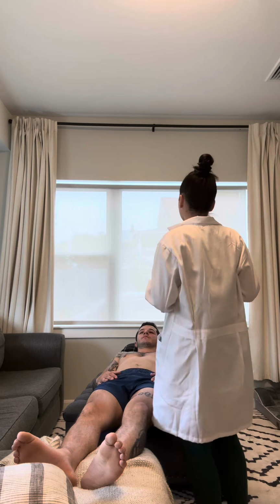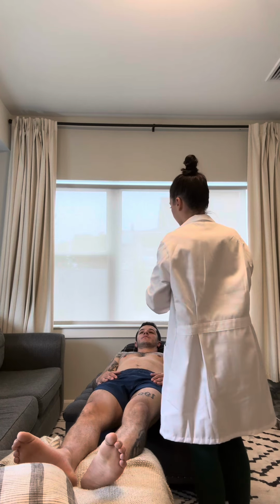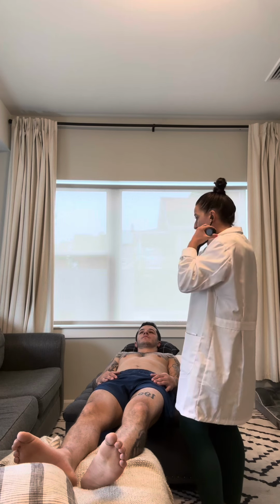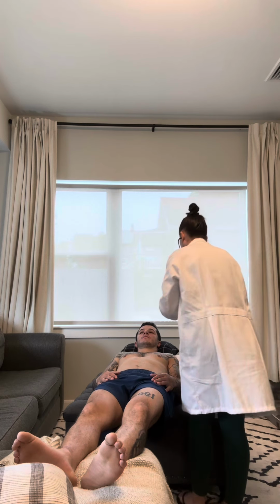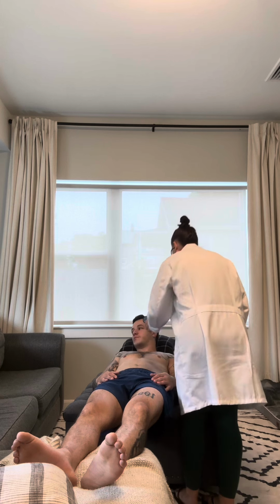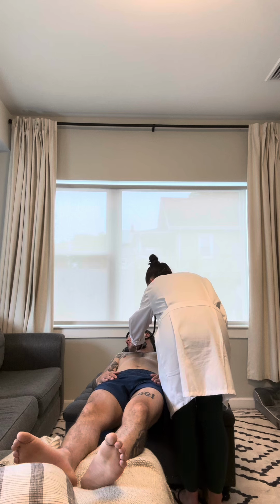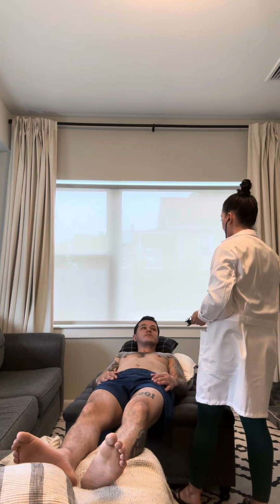So now we're going to move on to auscultating. What I'm going to do first is assess for any carotid bruits. So I'm going to use the bell of my stethoscope. Can you turn your head to the left for me? Good. I don't hear any abnormal findings. I don't hear any abnormal turbulence. Can you turn your head to the right?